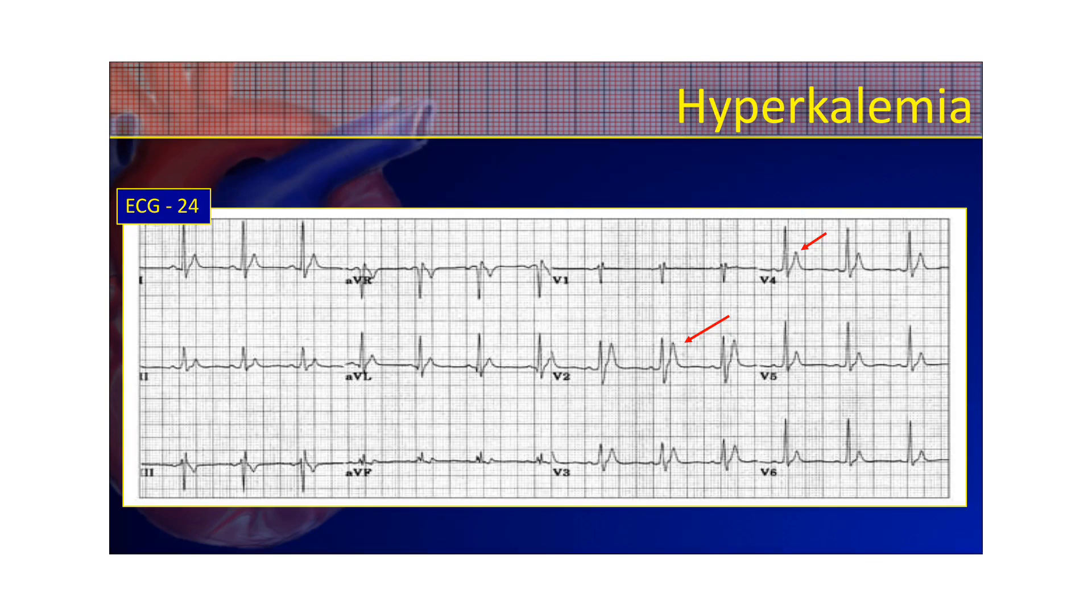Here's an example of a patient with hyperkalemia. This has been diagnosed. And you can see these very tall, skinny, sharp, peaked T-waves. And when I say sharp, just imagine touching the top of one of these T-waves, and you might actually prick your finger on them because they're so sharp, as Dr. Mattu says. So that's a good indication that they're not normal, and you may want to check the patient's potassium level.